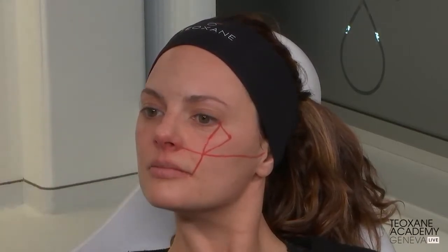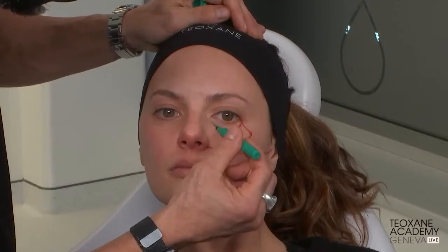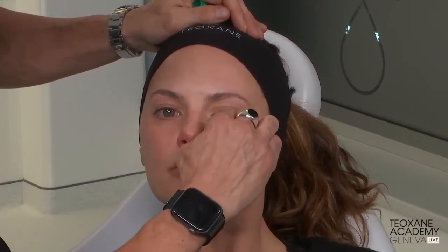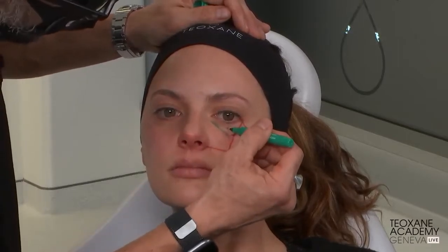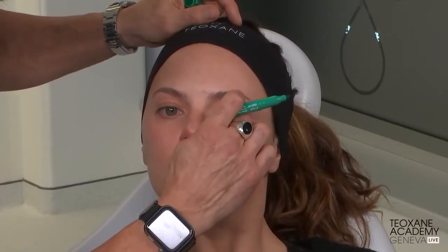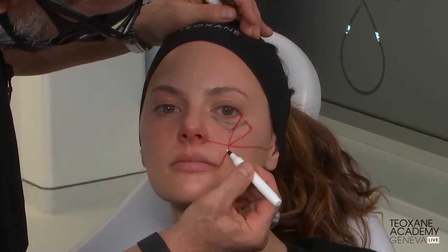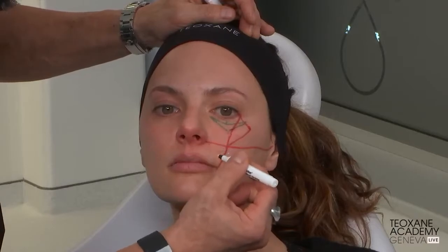So once we draw that, I like to continue with drawing the defect itself, which is the V deformity. And I just draw the defect. I then palpate the orbital bone with my finger, and I put my upper limit right at the orbital rim. So here comes my superior limit. From this part on, I will not go. So that is the orbital rim. So now I prepare myself for depicting the entry point, which is at the apex of the V deformity, of the inverted V of the smile, right midway on the nasolabial fold.